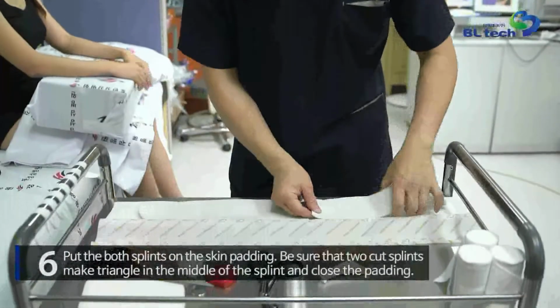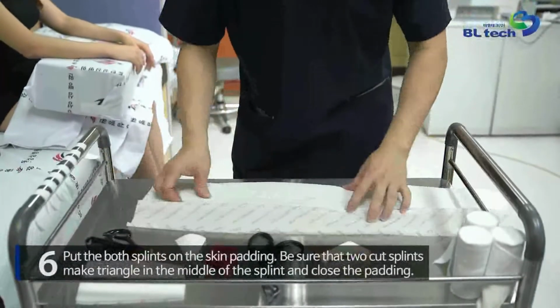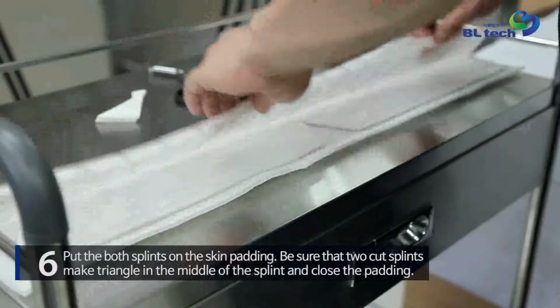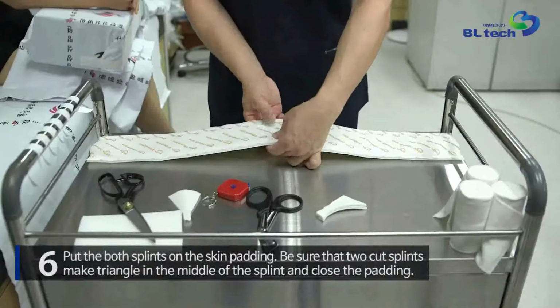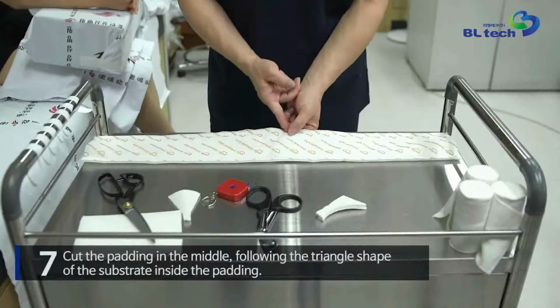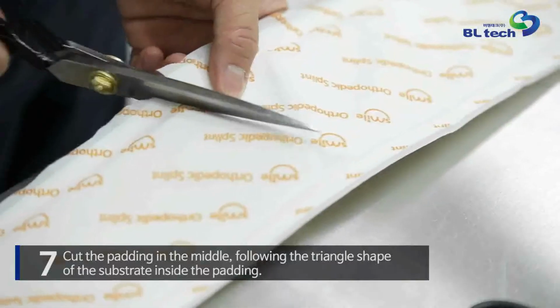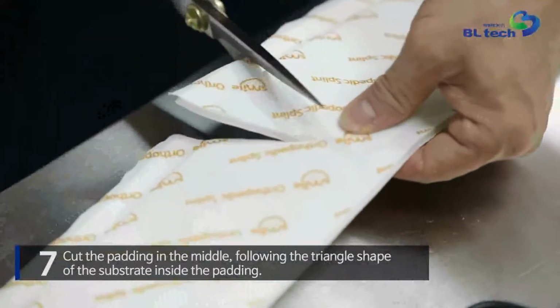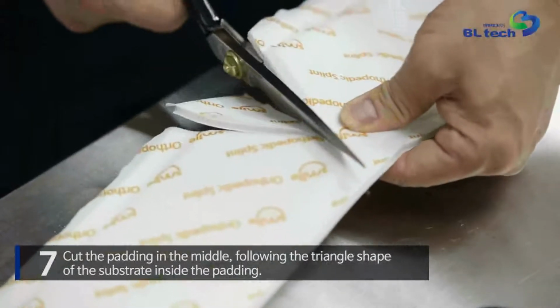Put both splints on the padding. Be sure that the 2 cut splints make a triangle in the middle of the splint, and close the padding. Cut the padding in the middle, following the triangle shape of the substrate inside the padding. Make sure not to cut the padding completely and leave 1 centimeter width of the padding.